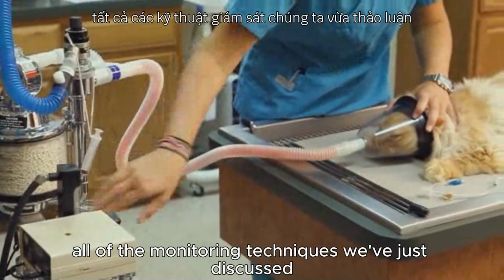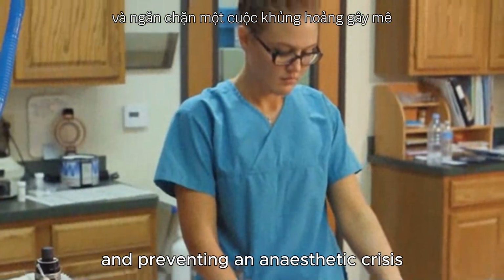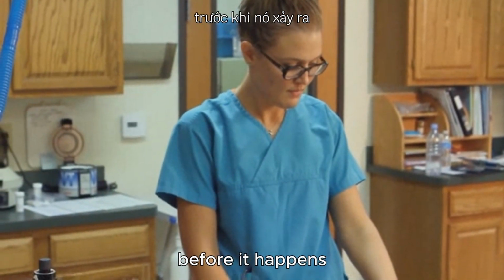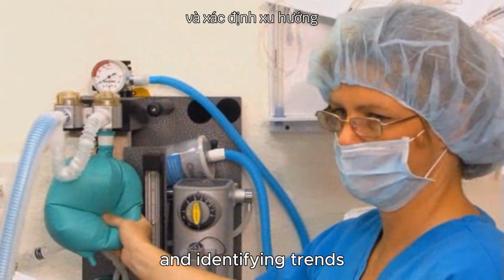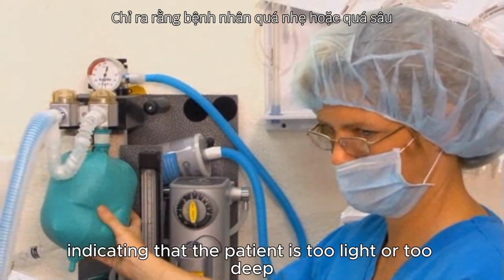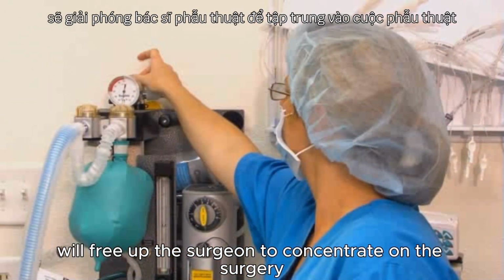All of the monitoring techniques we've just discussed serve the purpose of discovering and preventing an anesthetic crisis before it happens. Your ability to responsibly monitor the patient and identify trends indicating that the patient is too light or too deep will free up the surgeon to concentrate on the surgery.